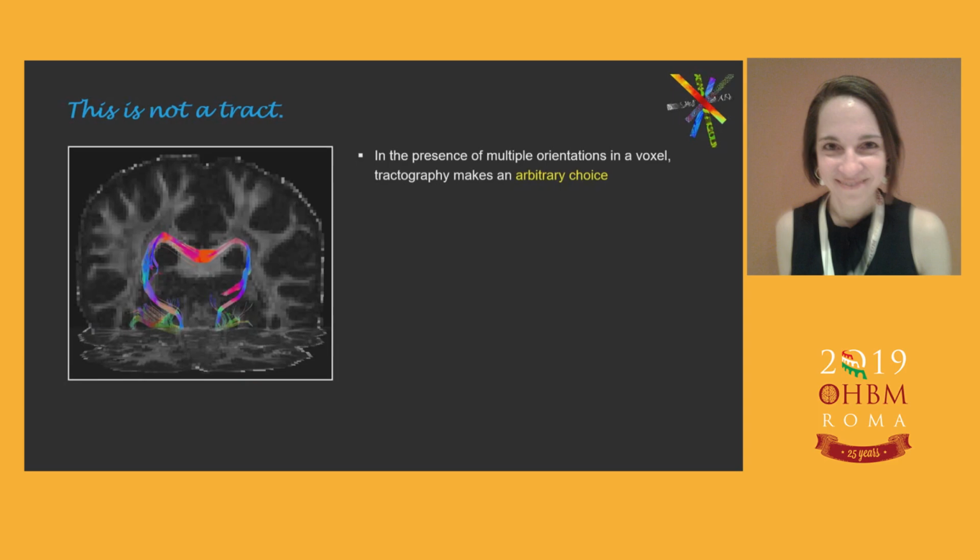This is an example where tractography took an obviously incorrect decision and turned from one bundle, from the corticospinal tract onto the corpus callosum. Now, this is a situation where you can tell with very little knowledge of neuroanatomy that we took a wrong turn somewhere, but in most cases, something that we see in tractography results, it's hard to tell if it's actually true or not, and that's why we still need ground truth on connectional anatomy to inform diffusion MRI tractography.